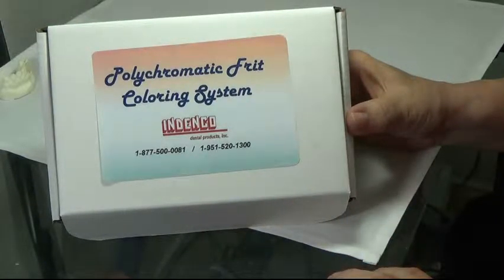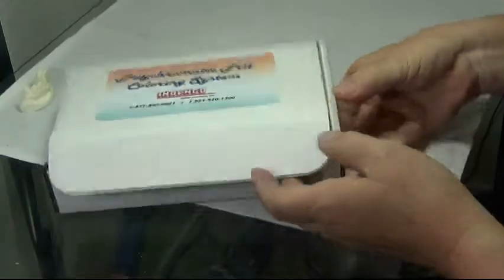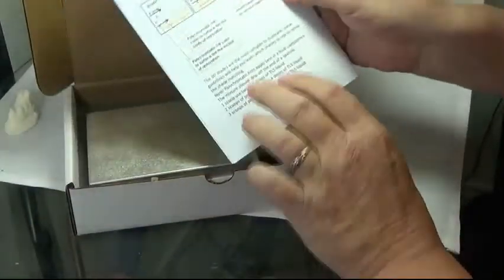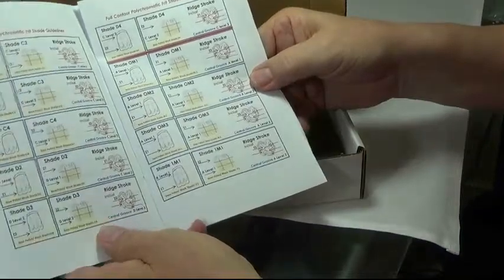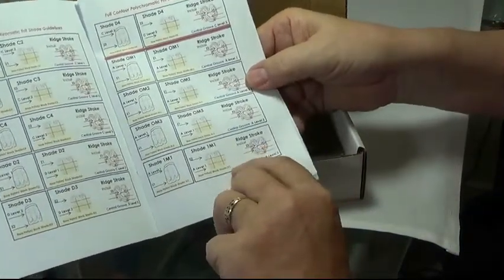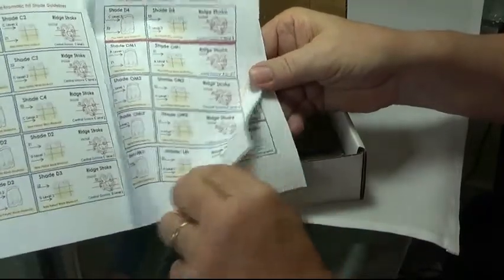This is your Indenco Polychromatic Frit Shading System Kit. I'd like to show you what we have before we start shading our crowns. First thing here is your shading booklet that contains all of the 3D shades and classic shades, and the block selection that you would use to mill your parts.